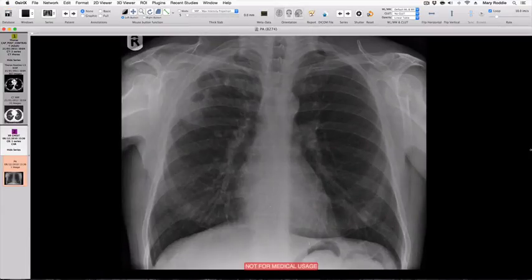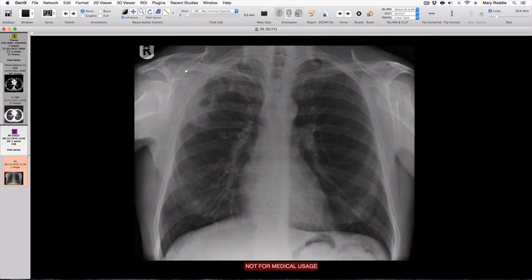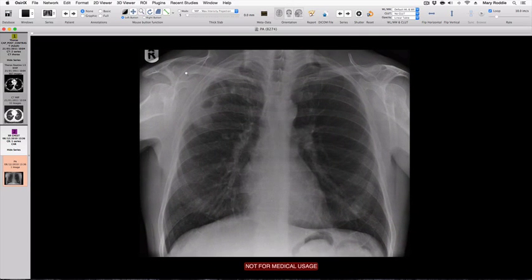An alternative way to export this image is to use a screen grab. In order to do that, you should minimize your image so that the 'Not For Medical Usage' logo is not overlying the image that you want to export.